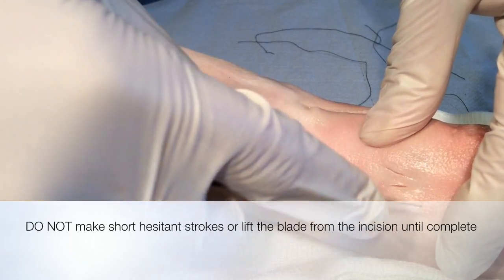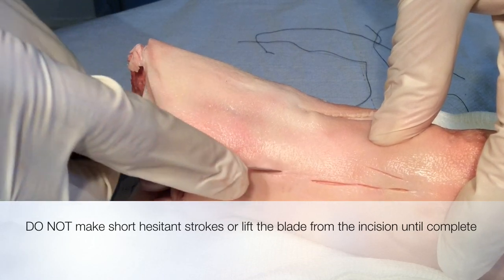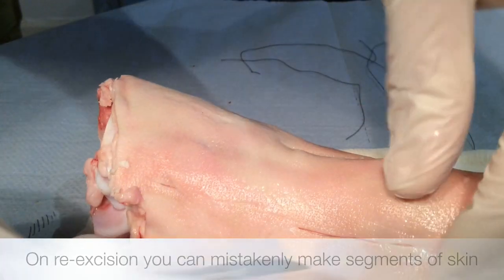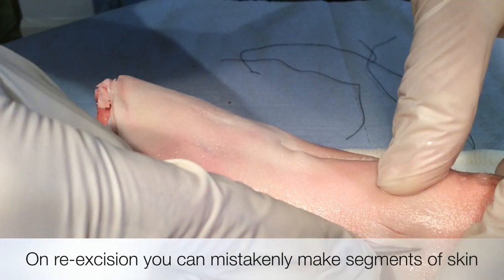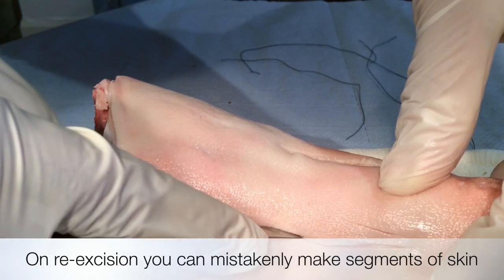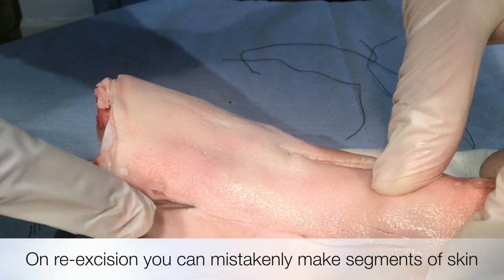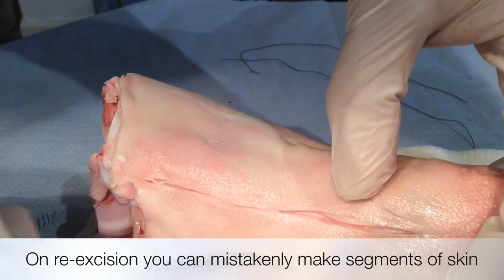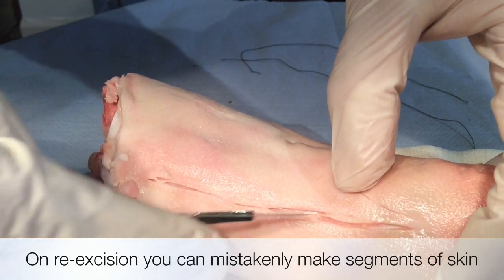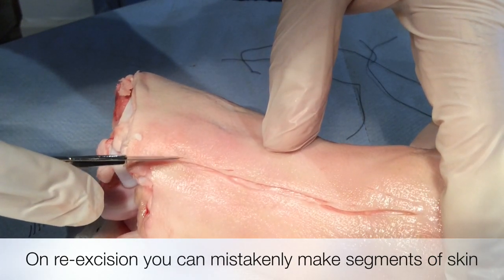Inexperienced scalpel handlers often make short, hesitant strokes that do not penetrate the full thickness of the skin. The incision is unequal across the wound length. The problem with this technique is that the user has to retrace the areas where the skin was only partially excised. As you re-excise, you can sometimes create segments of skin. These segments of skin can complicate the wound healing process and add difficulties to primary closure. In the clip, you can see one segment of skin there, and another segment of skin there.